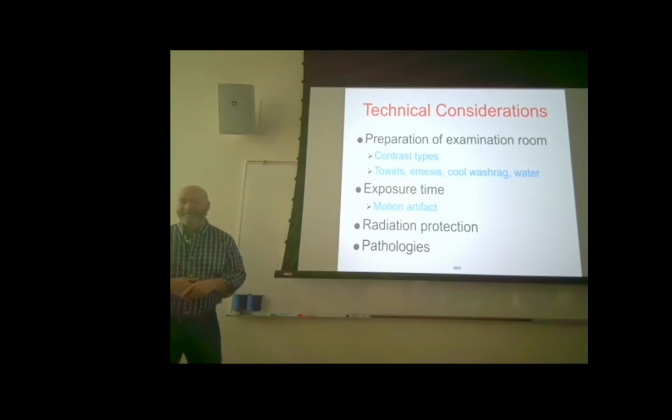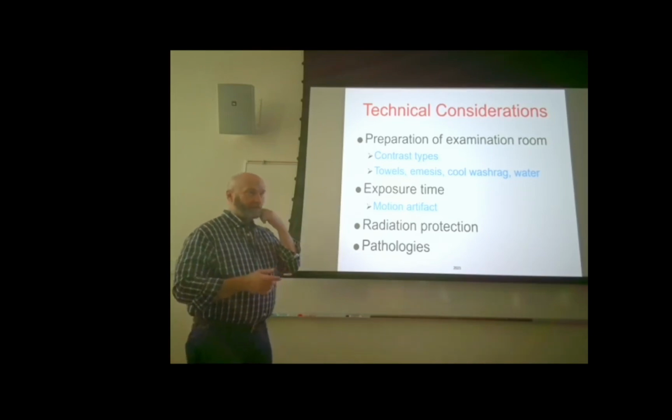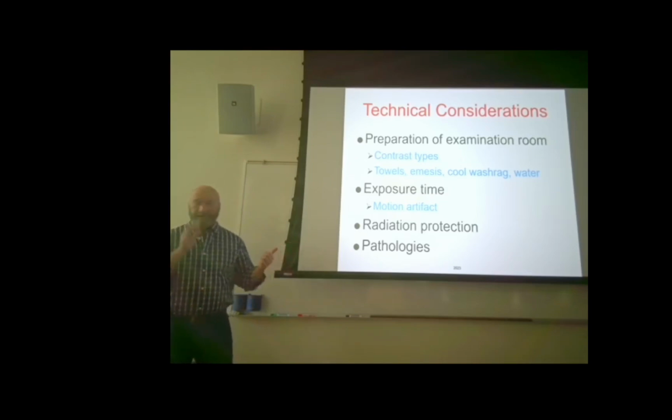Yeah. So when I was clinical instructor over at ETMC, when I first came to work at TJC, every class I would have the students taste the barium, and then taste the gastrografin, providing they weren't allergic to iodine. You know, where injectables, allergies to iodine may not matter with the iodinated drinkable contrast, it can matter. Okay, so make sure you get a good patient history and find out if they're allergic to iodine before you give them iodinated contrast.